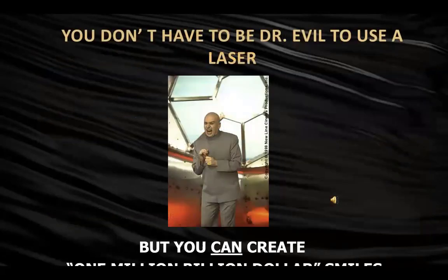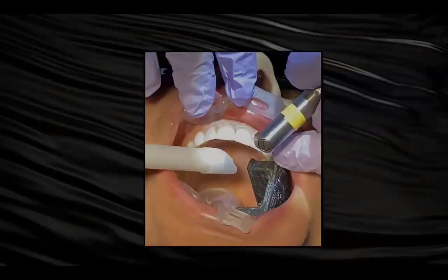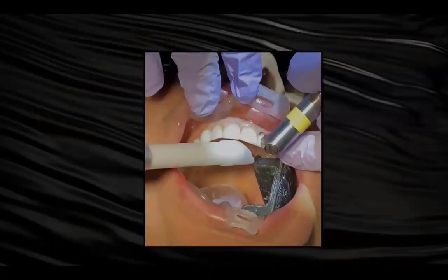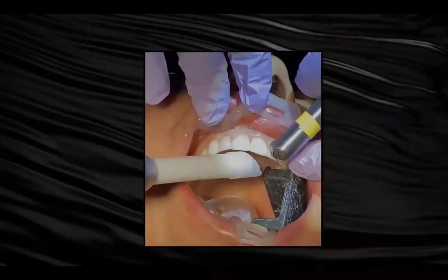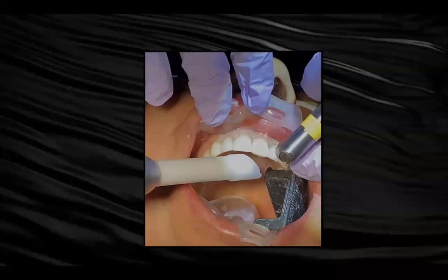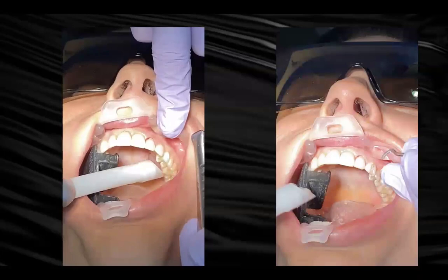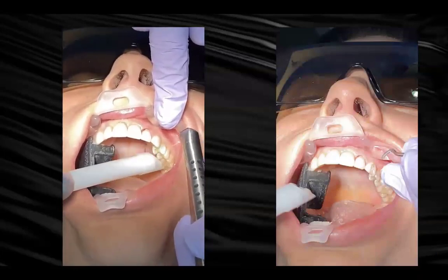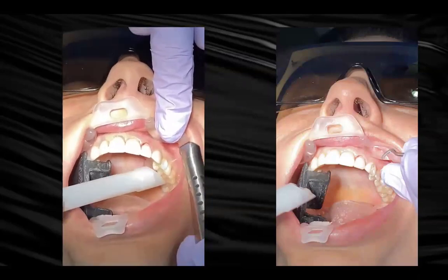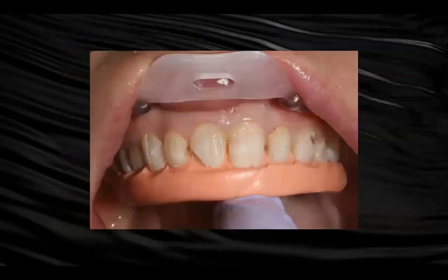Ladies and gentlemen, welcome to my underground lair. Little Austin Powers for you. Unfortunately, you probably didn't get to hear it, but I started out with my laser and sculpted Kelly's gums because I knew we needed to move that up and have it fit with the design that we were creating for her. A little bit of pre-priming. And what was really great, I'm using a Photona laser now, and you just see I'm popping veneers off because that was important to her. She did not want any tooth structure removed, and I'm going to try and move right along.